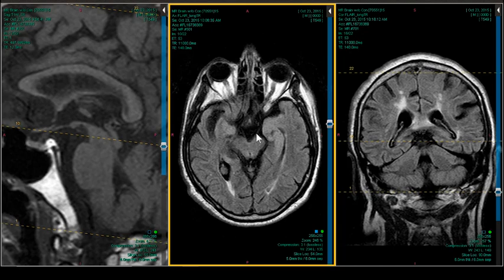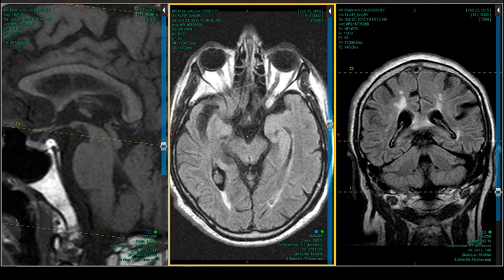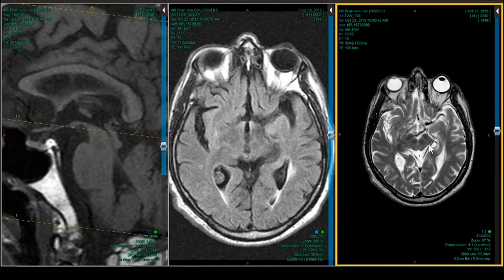Okay, just for a little anatomy. So here's your third nerves, right? Interpeduncular fossa. Let me make them a little brighter for you, so you can start putting your anatomy together. Sometimes it's hard to see that one. You've got a good one. Third nerves here, interpeduncular fossa. But the midbrain is just a little skinny, not a big chubby one like we saw in the last case. We'll see what it looks like here.